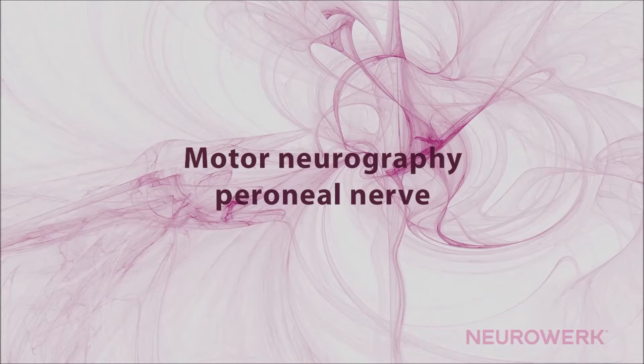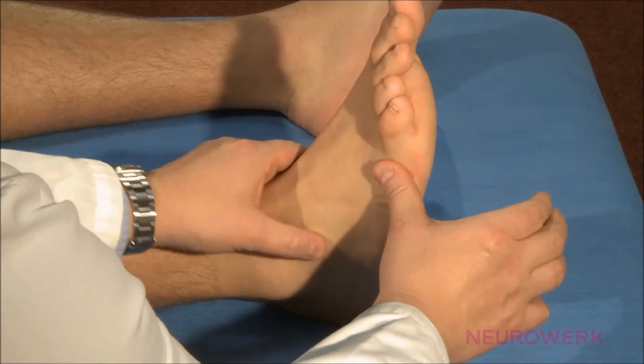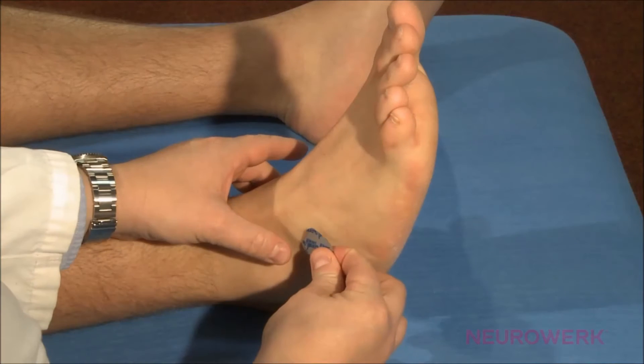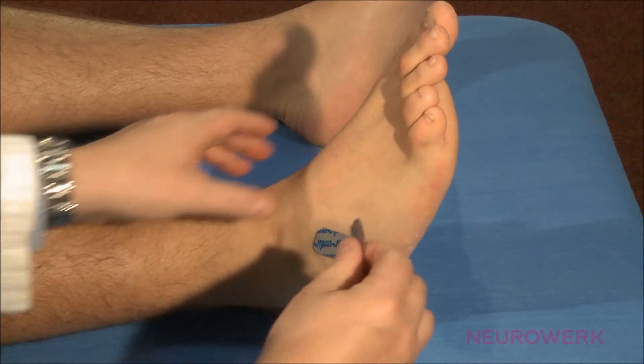Motor Neurography of the Peroneal Nerve. The peroneal nerve splits up below the head of the fibula into the deep peroneal nerve and the superficial peroneal nerve. The examination of the deep peroneal nerve is shown here.